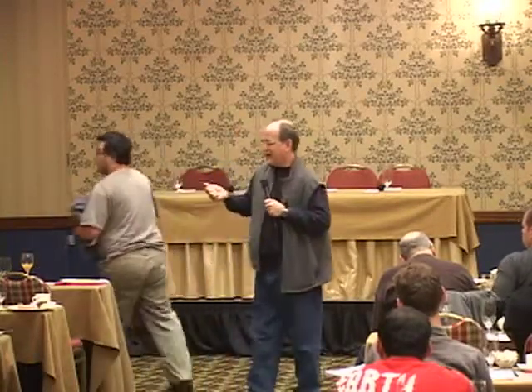Because if you're truly suspicious, can anyone give me a pathway which does not involve radiation? If you actually think the question needs to be answered, does this person have coronary disease, how do you get at that answer? The lower the risk, okay, let's start with plain stress testing. It's the only mechanism you have available where there's no radiation. But the lower the risk, the higher the probability of a false positive. But also with low risk, the higher the probability, paradoxically, of a false negative. So for the population you're most concerned about, it's the worst test.